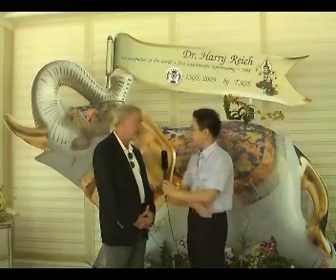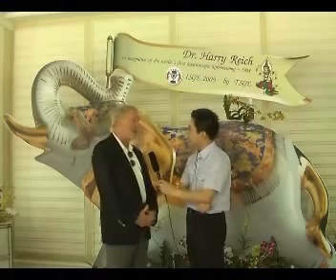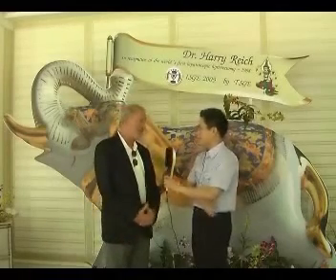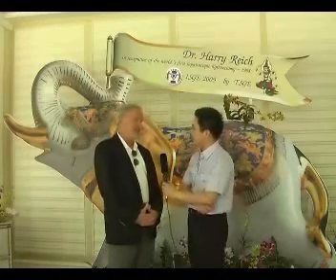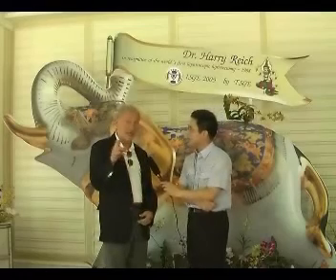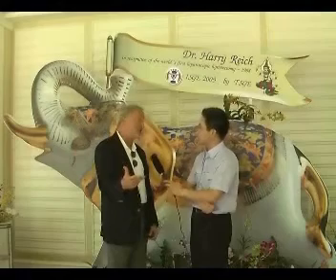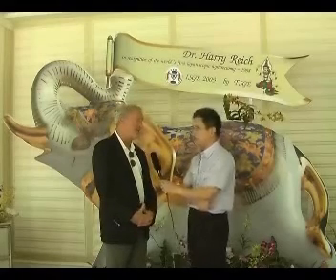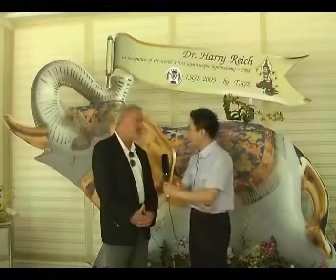So at this time you used bipolar to ligate the artery? I started with bipolar and then I went to suture. I think for the uterine artery it's always safer with suture, because if you ever come close to the ureter or get the ureter, you could always take the suture off. With bipolar, what can you do? It means reimplantation of the ureter into the bladder. Maybe at that time you worried about electrical injury? Not much, because we had bipolar. With bipolar, the electricity just goes between two electrodes back and forth. So as long as you can see the tip of your instrument, you don't worry about the current going through another organ back to the machine. That's the world's first total laparoscopic hysterectomy.